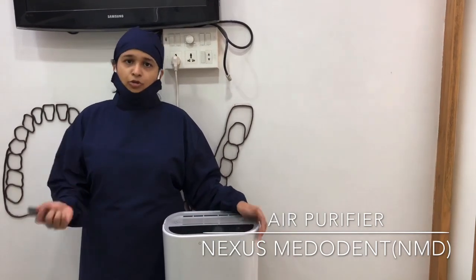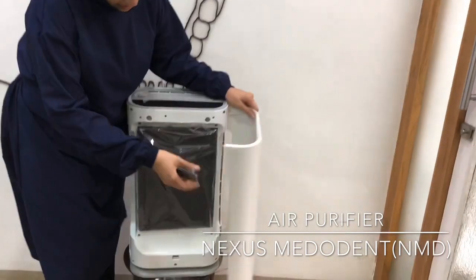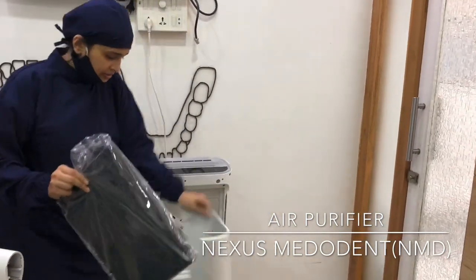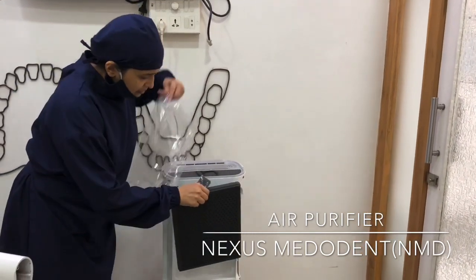I am going to show you how, when you get the machine installed, how you need to install it. You need to open this and there is a filter — a 3-layer filter — and you need to remove it from the plastic, put it back.